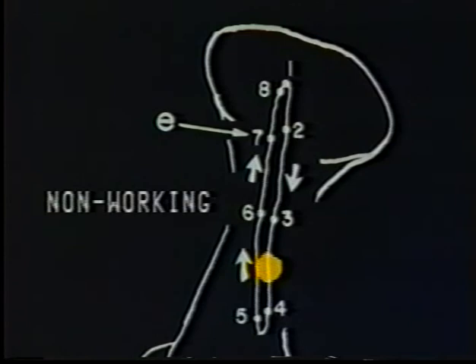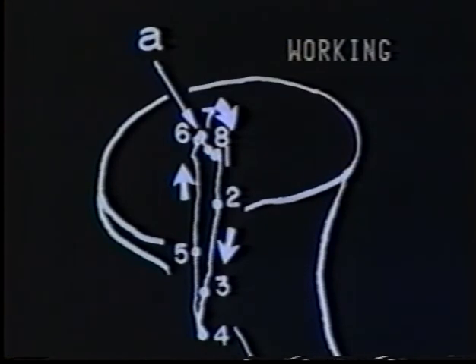The non-working side condyle makes a smooth closing movement directly to its intercuspal position at point 1. The working side condyle, however, makes a final closure movement from 7 to 8 to 1, represented by Bennett movement or side shift adjustments of articulators.